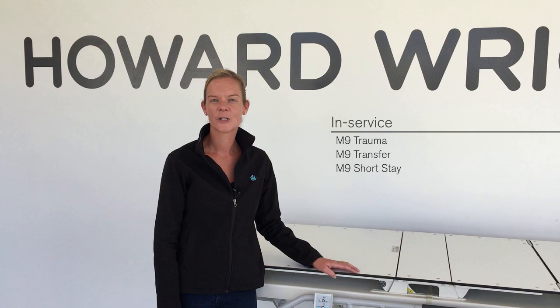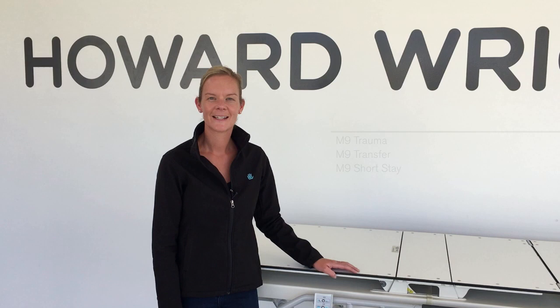Thank you for choosing a Howard Wright stretcher. This short video covers the operation of an M9 trauma stretcher, but applies to all Howard Wright stretchers. Please read and understand the instruction for use manual and remove all packing materials before use.